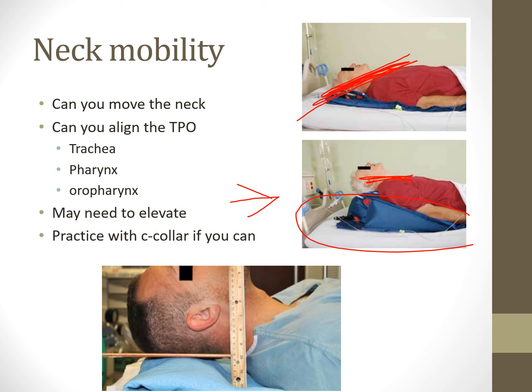If you're able to do something to line up the ear with the sternum, that will allow for the best possible view of intubation. It will make it so much easier, but you need to make sure that their neck, their C-spine, their everything there has the ability to do that before you start messing around, because that could cause serious other issues.